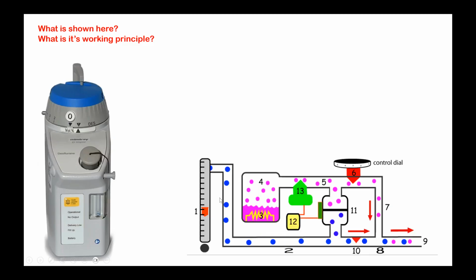this is the construction of that desflurane vaporizer. See how the fresh gas flow is coming through this, and this is the chamber separately vaporizing the agent, and these are all the pressure transducing valves. So there is a control here, and there is a pressure transducer which is sensing the flow of gases, and that only depends on the dial setting.